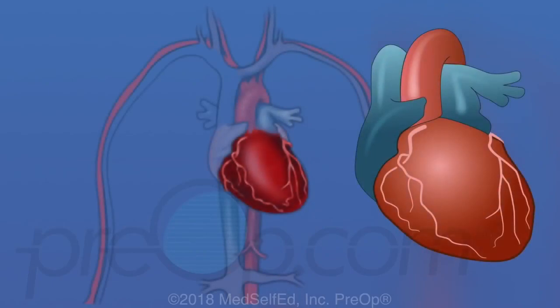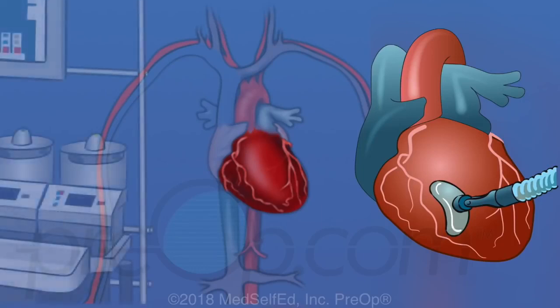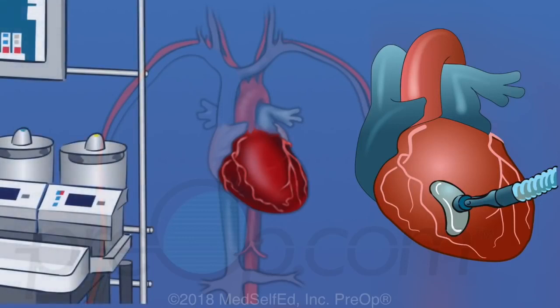During an off-pump procedure, the heart is not stopped. Instead, special tools steady areas of the heart while the surgeon stitches grafts into place. The pads and arms of the tool brace the moving heart muscle to hold small sections still. A heart-lung machine is kept on standby during off-pump surgery. The pump can be necessary to help manage some situations during surgery.